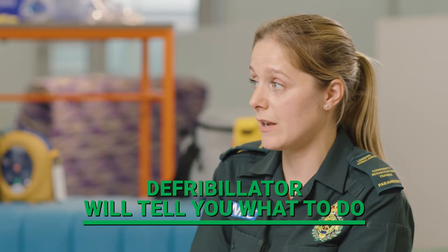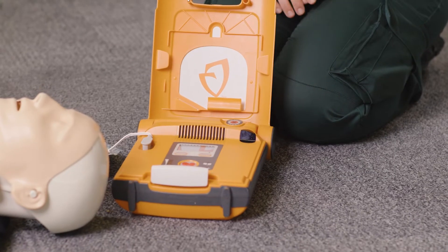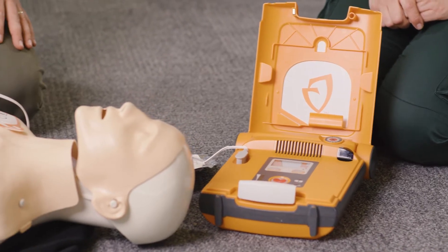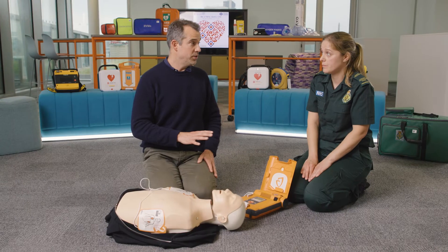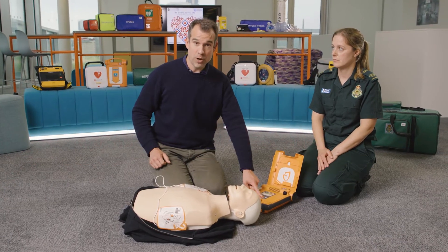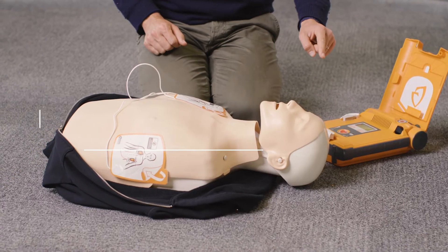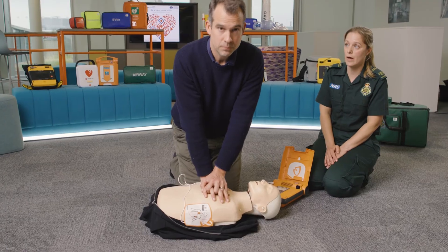The defibrillator will tell you exactly what you need to do. If a shock is required, the machine will let you know: 'Shock advised, do not touch the patient. Press red flashing button to deliver shock.' We need to ensure everyone stands clear — say 'stand clear,' then tell everyone you're shocking while looking at the patient. Shocking. Once we've delivered the shock, get straight back on the chest and deliver chest compressions until medical help arrives.